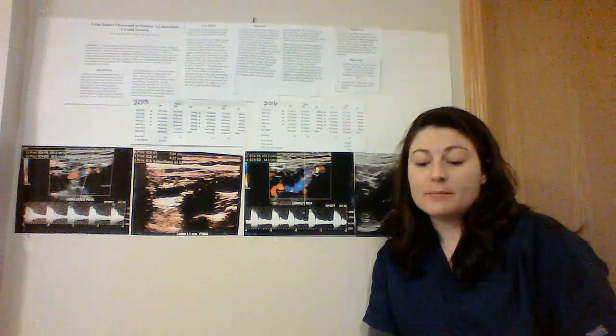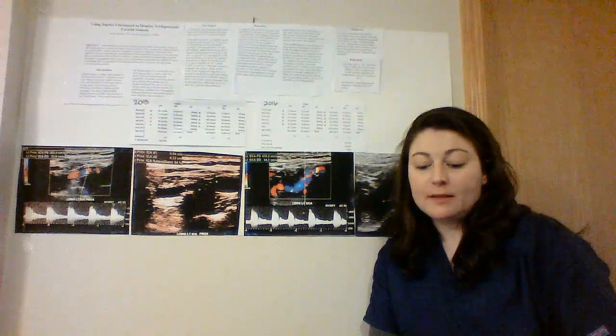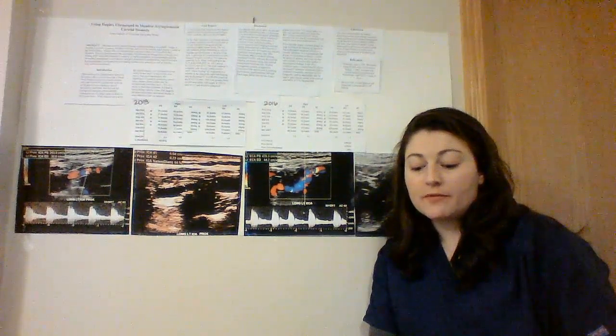In this case, we have a 79-year-old male present with a known stenosis, and he is asymptomatic. His last comparable ultrasound duplex exam was from 2013, and the most recent is from April of 2016. On the right side, there was minimal amount of plaque visualized in the CCA, the ICA, and the ECA. No measurements were taken, and the peak-systolic ratio was 1.0. The right vertebral flow is antegrade and within normal limits.